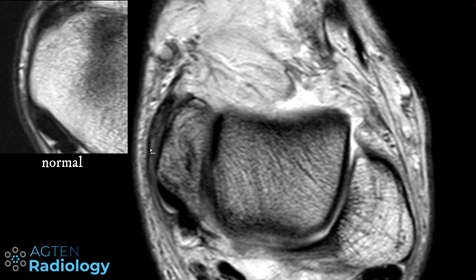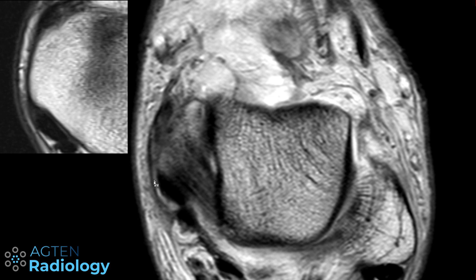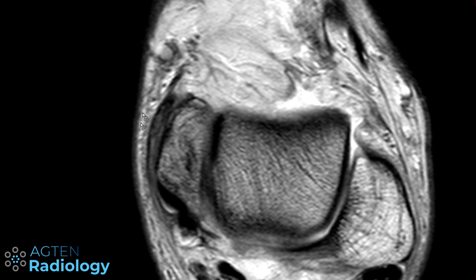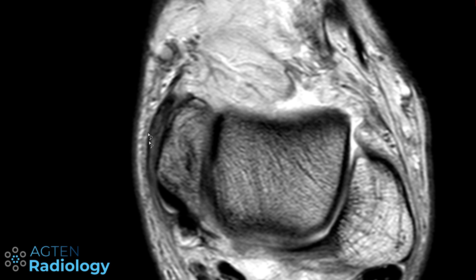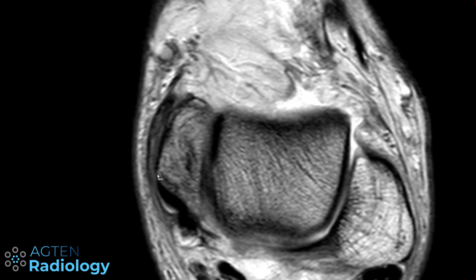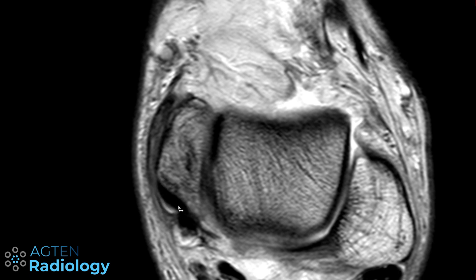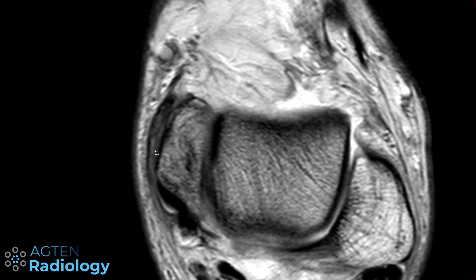The ligament is stripped off from the medial malleolus together with the periost — this black structure here is the periost, this is the ligament stripped off. Here we have the continuation with the flexor retinaculum also stripped off from the bone together with the periost. So this is the fascial sleeve of the medial malleolus stripped off from the bone. You can also understand that if the flexor retinaculum is not inserting here anymore, potentially the posterior tibial tendon might have a stability issue.